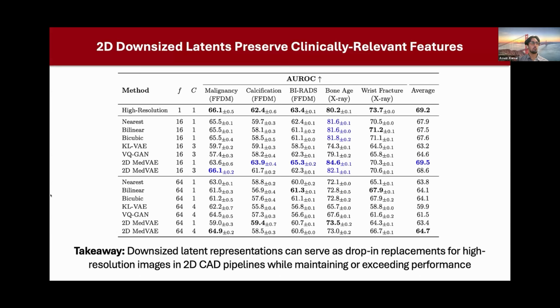We further note that the interpolation methods for most of these tasks are pretty competitive baselines as well to MedVAE. But our findings do suggest that our MedVAE training procedure yields downsized latent representations that can be used as drop-in replacements for high-resolution input images in these computer-aided diagnosis pipelines while maintaining or exceeding performance. So still very promising results in the 2D domain.